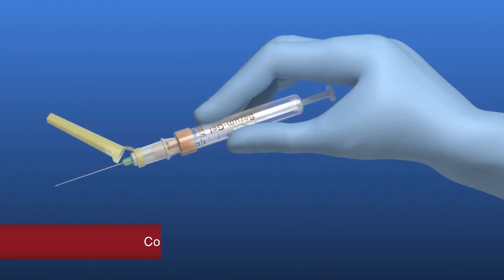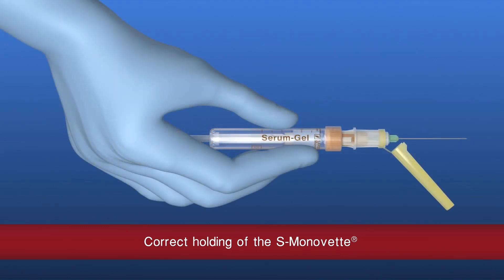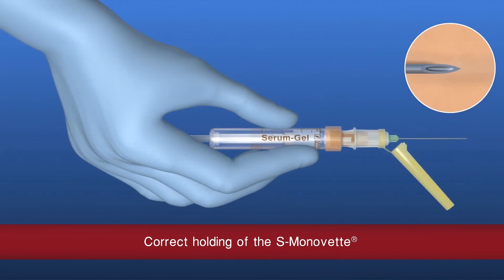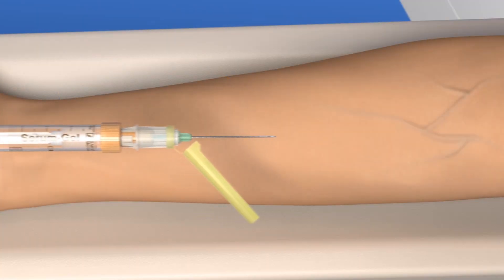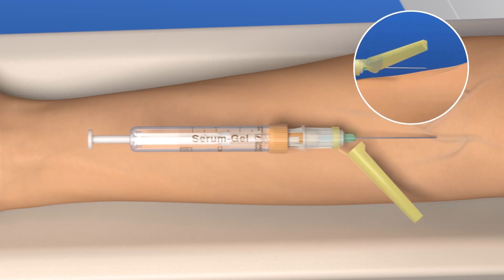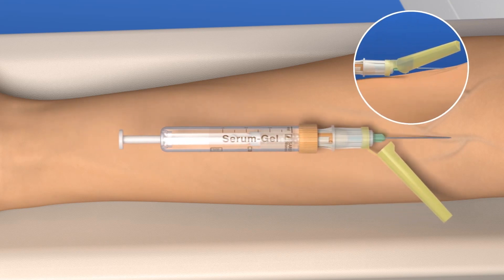After removing the protective cover, hold the safety needle with the needle bevel facing upwards. The needle protector should always be on the right-hand side. Stretch the skin and hold the vein in place. To avoid piercing through the vein, puncture it at a flat angle.